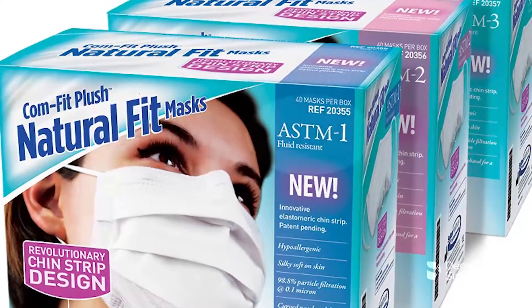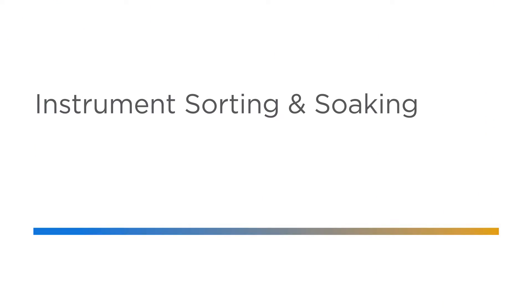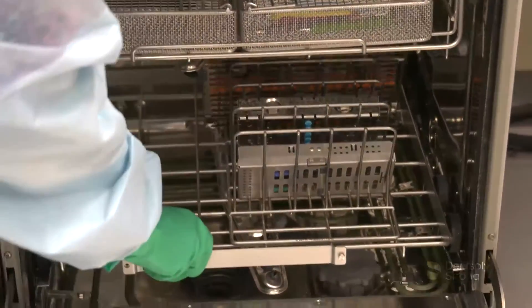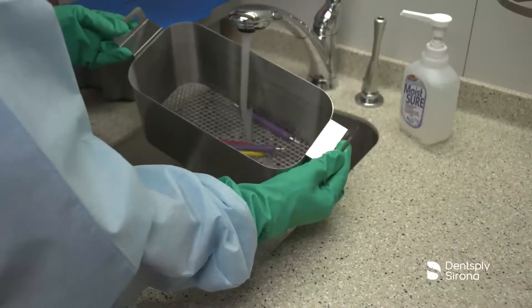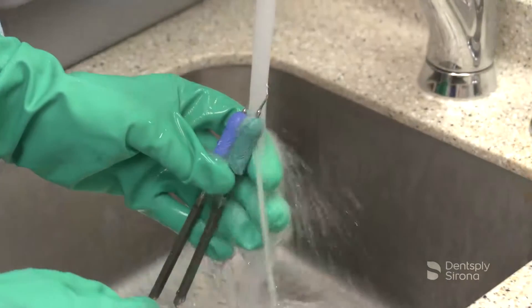Clinicians should use the ASTM levels of protection to help determine proper mask selection based on the procedure they are performing. After all soiled instruments and devices have arrived to the reprocessing area, they must be sorted for proper handling and processing. Hand instruments, Cavitron inserts, and handpieces are all cleaned, disinfected, and sterilized in various pathways. It is essential that the manufacturer's recommendations are followed for each individual device being reprocessed.